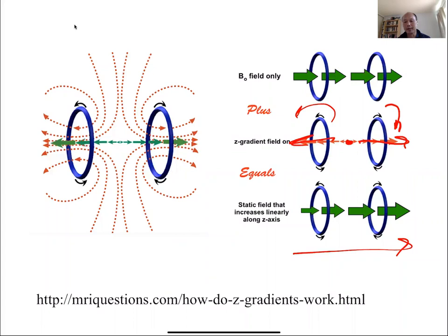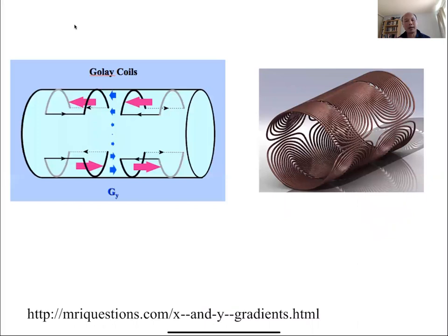And the same principle, you can extend to X and Y gradients. As you can see, they have very interesting designs. Designing gradients as a whole is a subspecialty on its own that requires a lot of expertise.